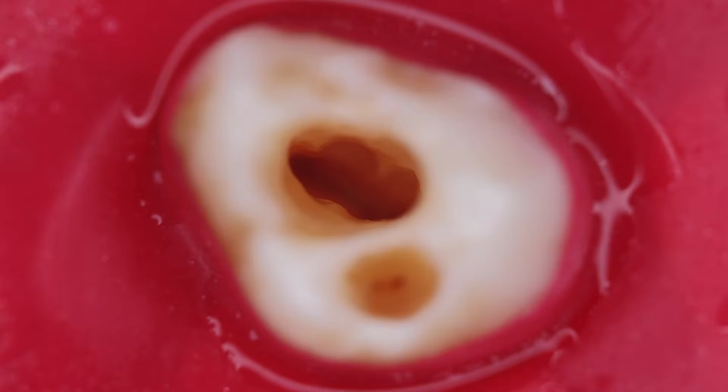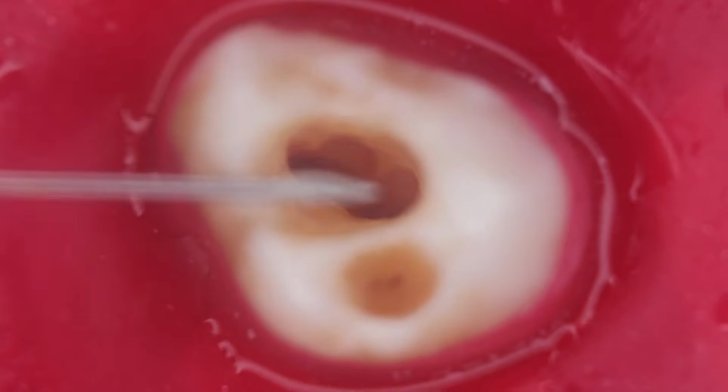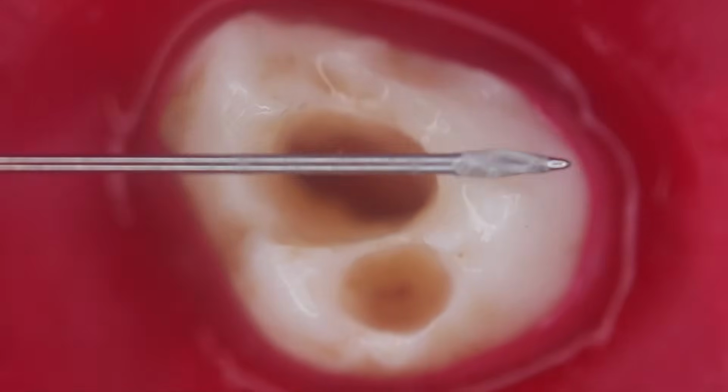See, now the canals have been enlarged with size 2. So just look at it once again. I am showing you. This is the GG drill and this is size 2. So we have enlarged with size 2 and now we are going to enlarge with size 3.